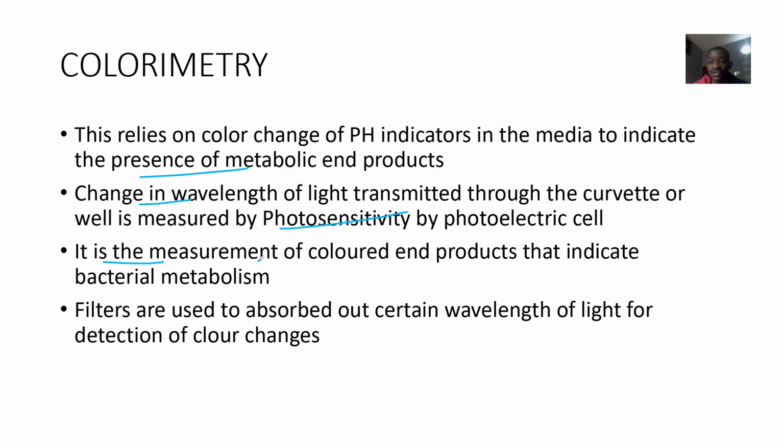Now that's just the principle you have stated. Filters are used to absorb out certain wavelengths of light for detection of color changes. Probably you might just put some examples of bacteria here. It can be used to detect the presence of, and so on.